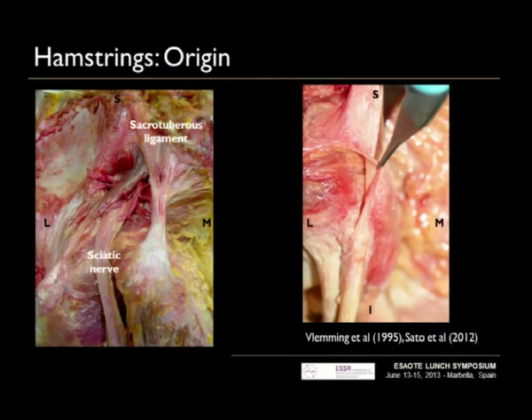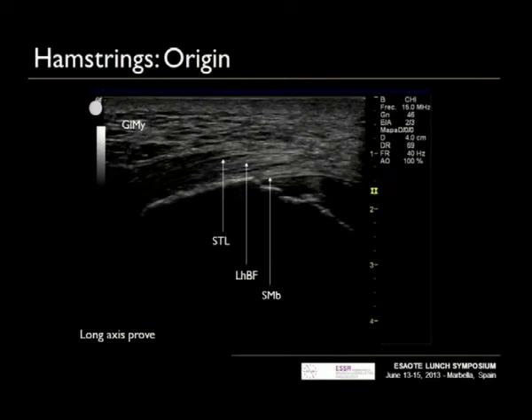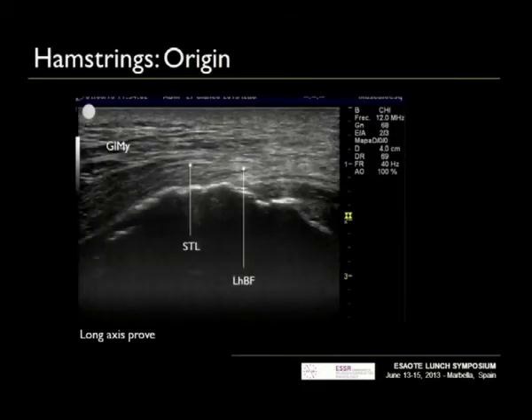This can explain, as Dr. Martinoli said to me, that some injuries of this part of the hamstrings could cause pain in the superior area. In this ultrasound picture, we can see the gluteus maximus in a longitudinal view — the gluteus maximus and the origin. This is the ligament, and we can see how the ligament continues with the long head of the biceps femoris and how it covers the most superficial fibres of this tendon. In the deeper area, we can see the semimembranosus tendon origin. It is also possible to see in this area how the ligament covers this longitudinal head of the biceps femoris muscle.